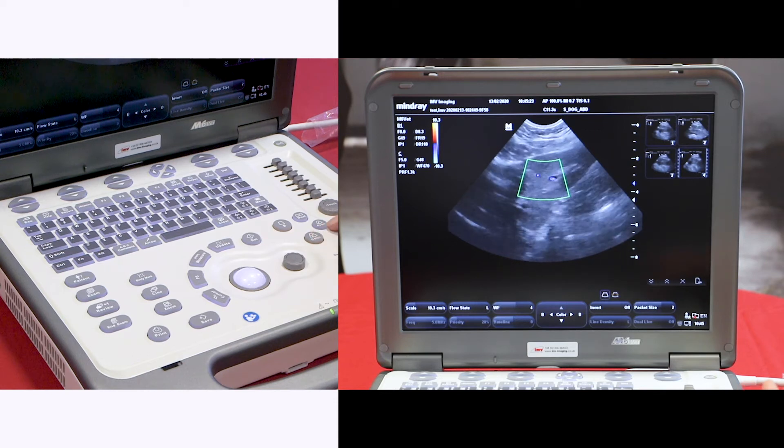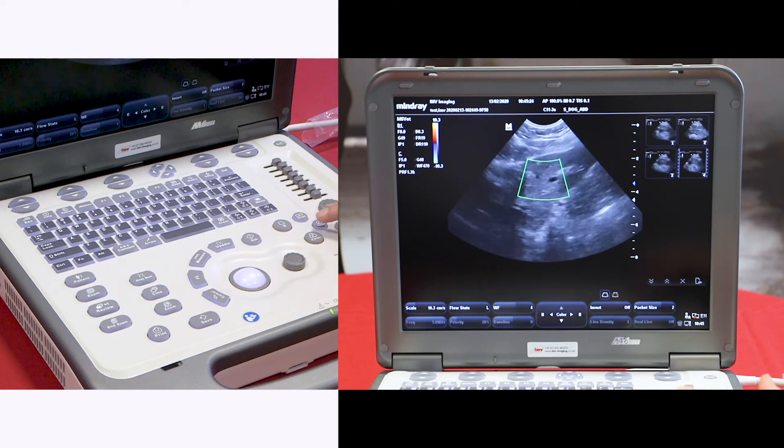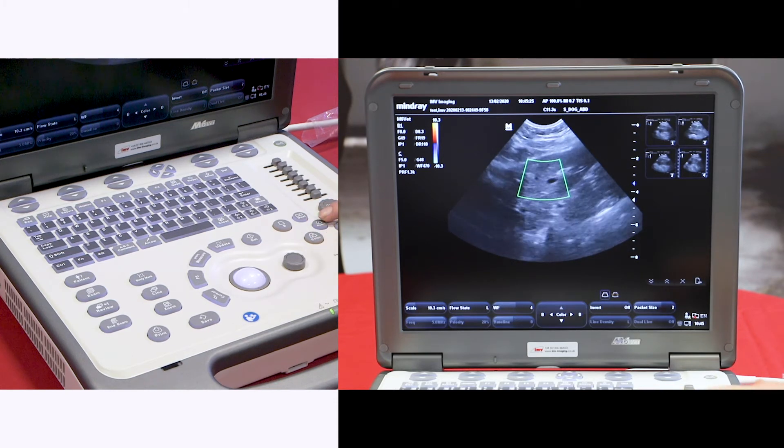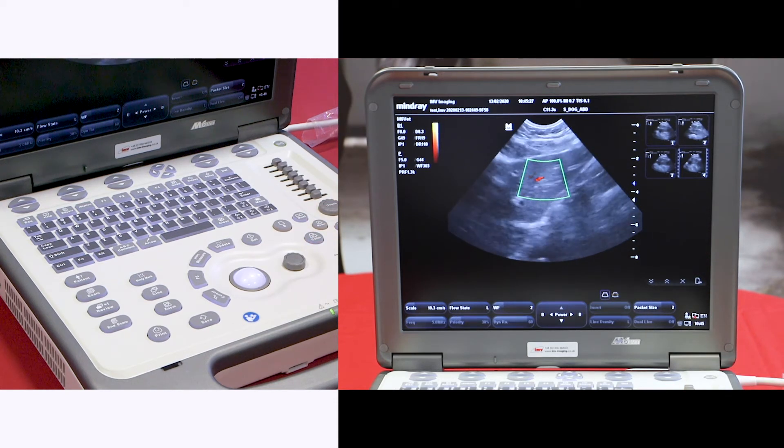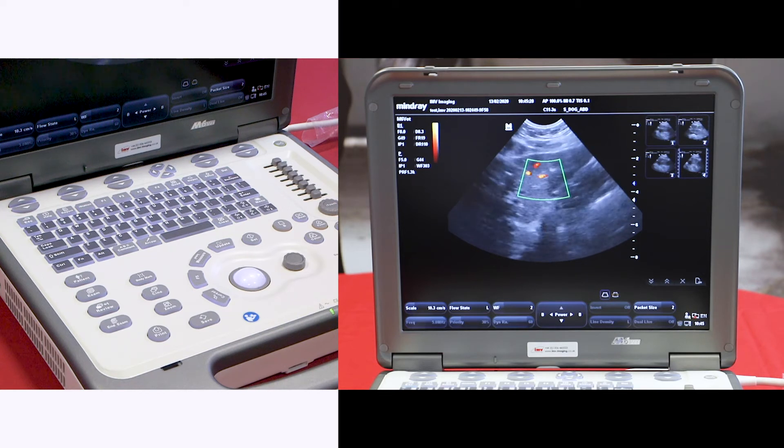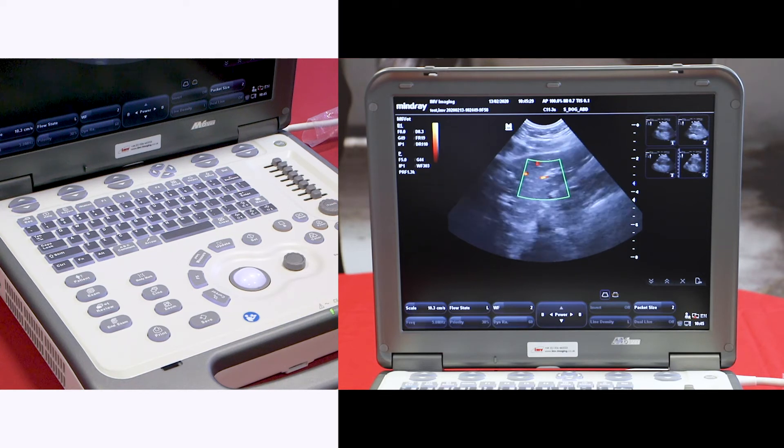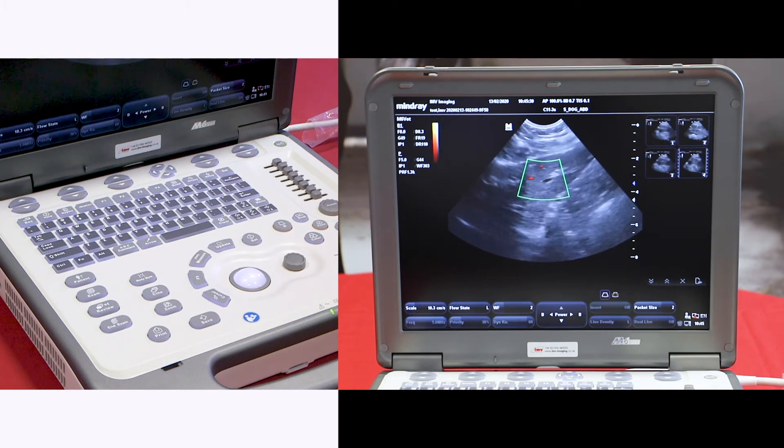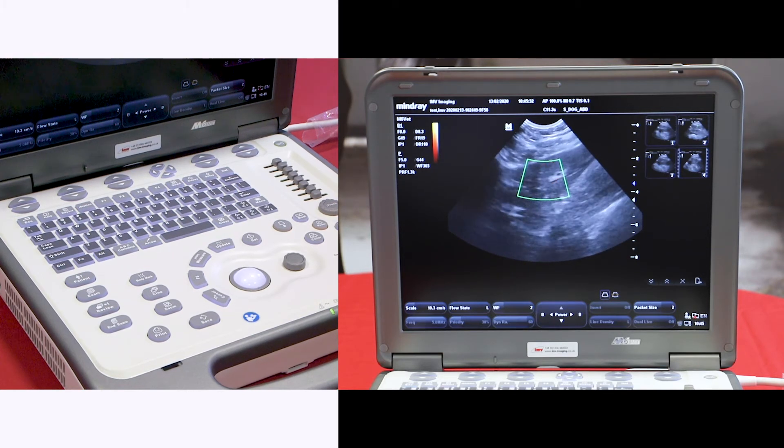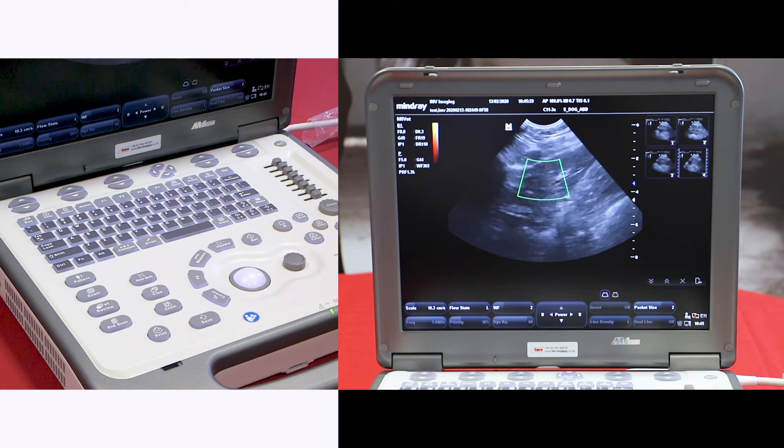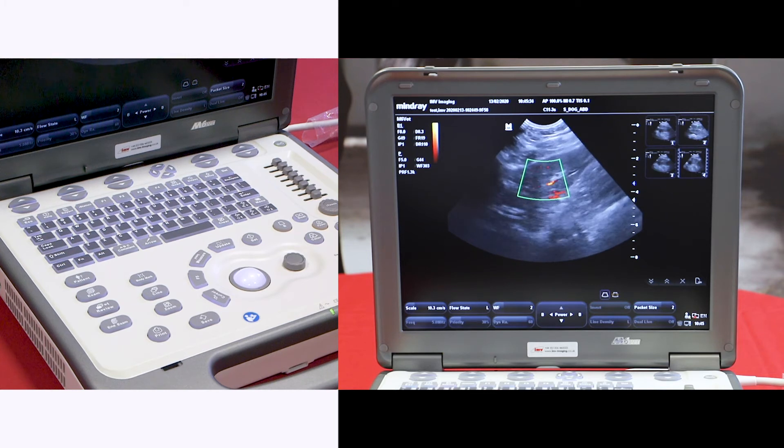Alternatively, in the abdomen it's also useful to try power doppler. This doesn't give you direction of flow, but it does give you presence or absence and is more sensitive to low velocity flow.